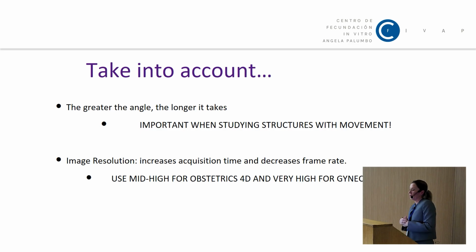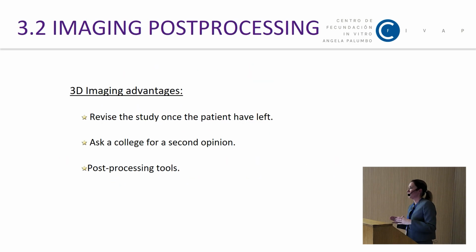So remember that at the moment of the acquisition, we must consider that time increases with the angle and with the image resolution, as Peter and Marcelo tell us. This is important when we are studying moving structures, so we use mid or high for obstetrics and very high for gynecology, and always adjust the angle to the region of interest.